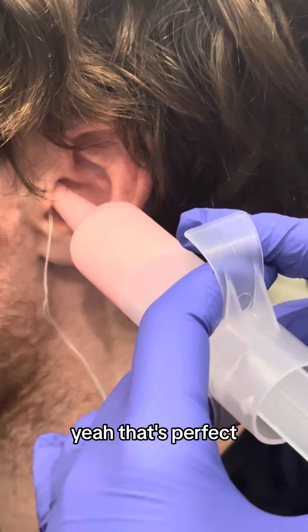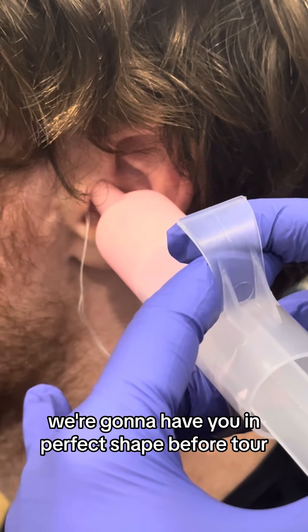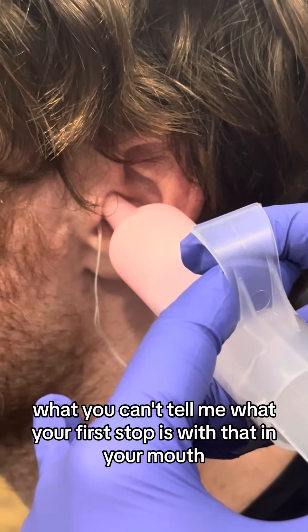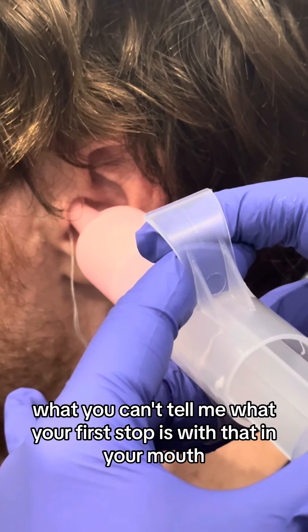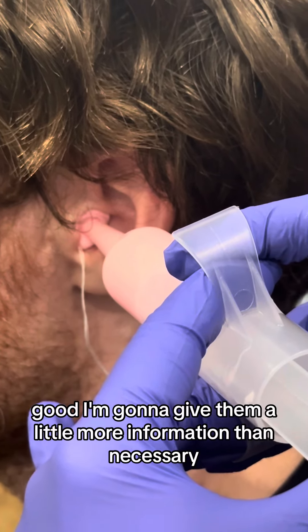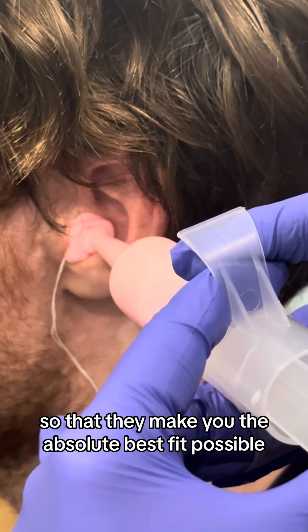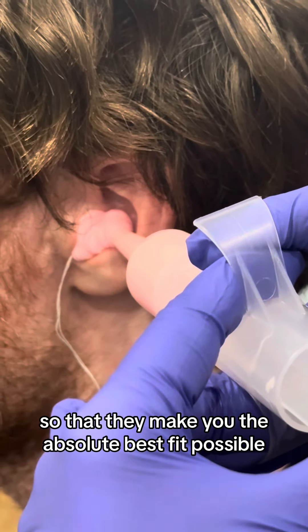Go ahead and bite that the long way. That's perfect. Well, we're going to have you in perfect shape before tour. What, you can't tell me what your first stop is with that in your mouth? I'll ask you after. I'm going to give them a little more information than necessary so that they make you the absolute best fit possible.